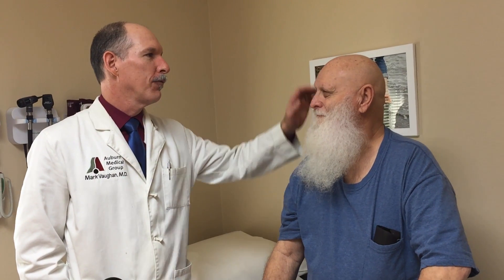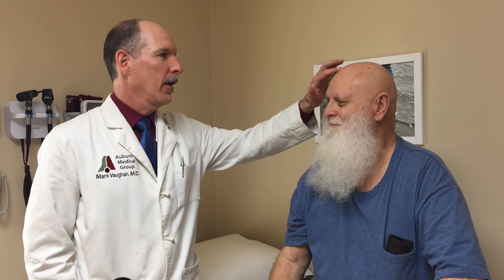What about being Santa Claus for Christmas this year? Did you put up your funny hat with a ball on the end? Oh, it's disappointing. Okay, well let's get started. We'll first do the freezing here — this actinic keratosis — and we'll get a close-up of that.